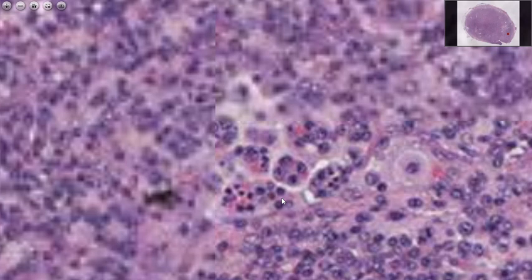the photos are very blurred because of two applications simultaneously opening on my computer, or the internet connection is not very good. I'm opening a screen recorder as well as the window for the virtual slide, and this makes the computer really struggle to comprehend what is going on on the screen, and that's why we are not seeing very clear photos. I'm sorry, later maybe you can see a clearer photo.